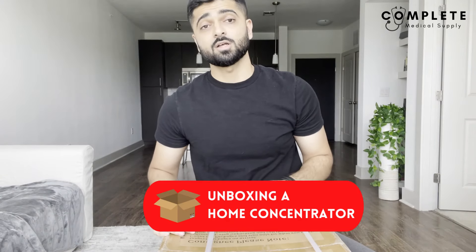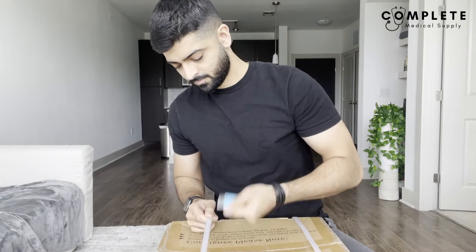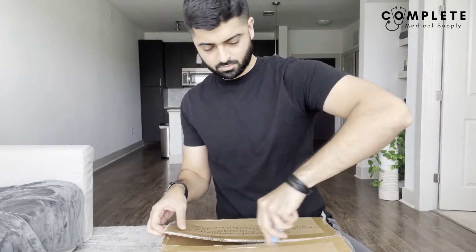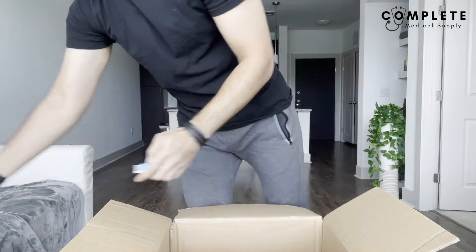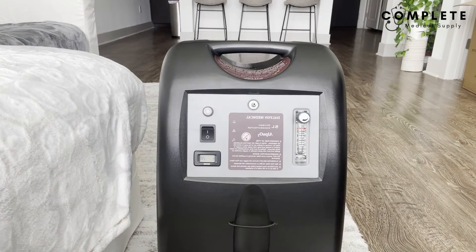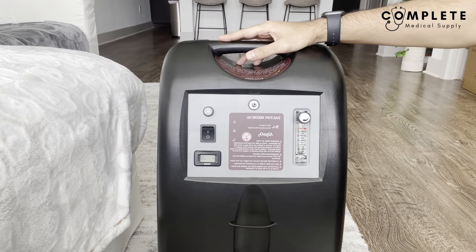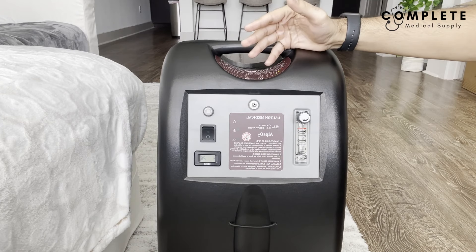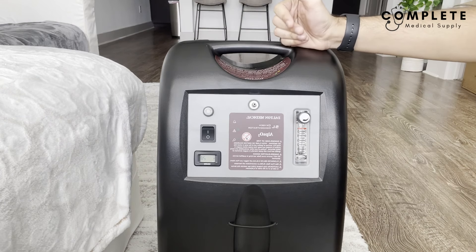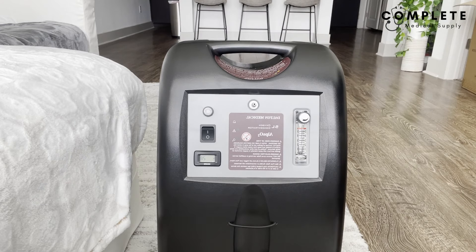Now let's move on to the second part of the video where I'm going to unbox a home concentrator and also a portable concentrator to show you the differences on how to use them. The first thing we have here is the concentrator itself — this is a five-liter home concentrator by Dalton Medical. There are a lot of brands out there but they all do about the same thing, which is filter and create oxygen.